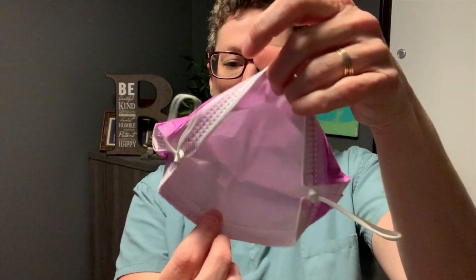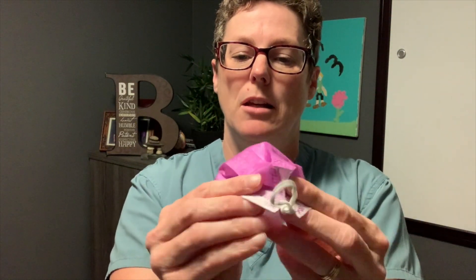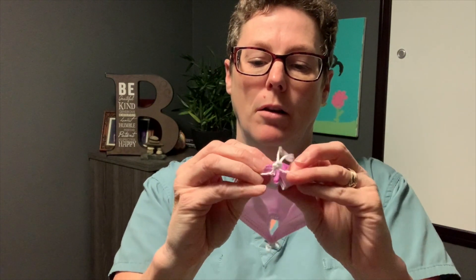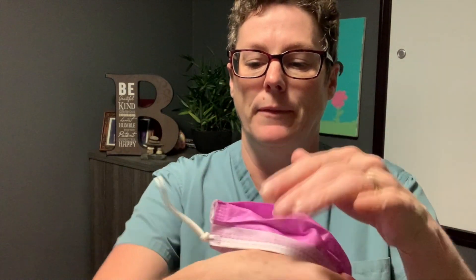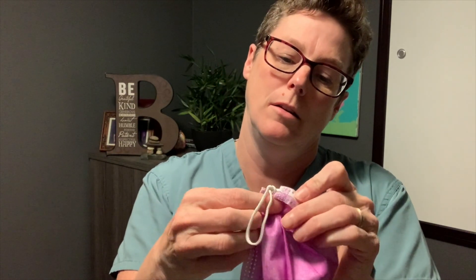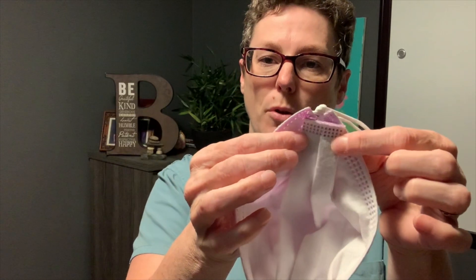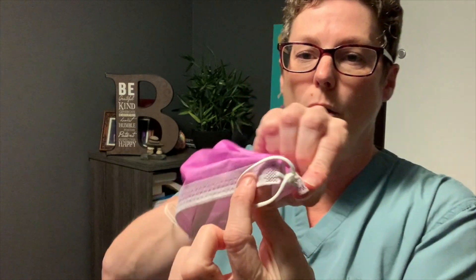Now we're going to open up our mask, and what you're going to notice is I've got these two openings. We're simply going to close those off by taking the outside of the mask and pushing it through down past that knot, so it should look a little bit more like this. On the inside you'll now see the folded piece. That hole is gone.